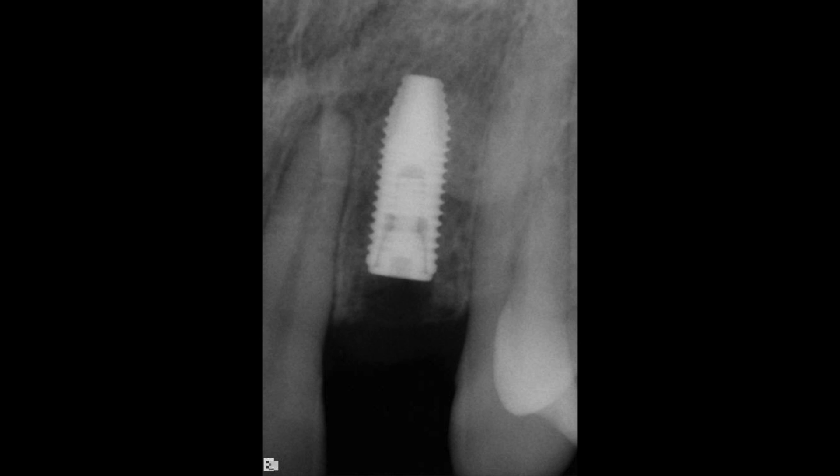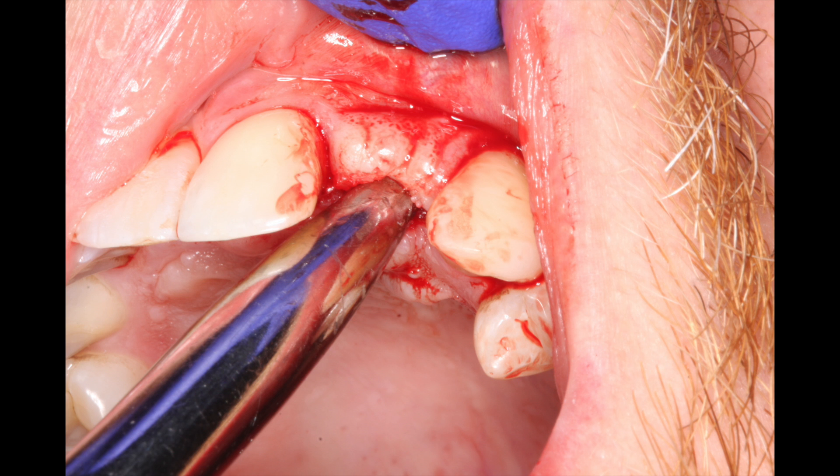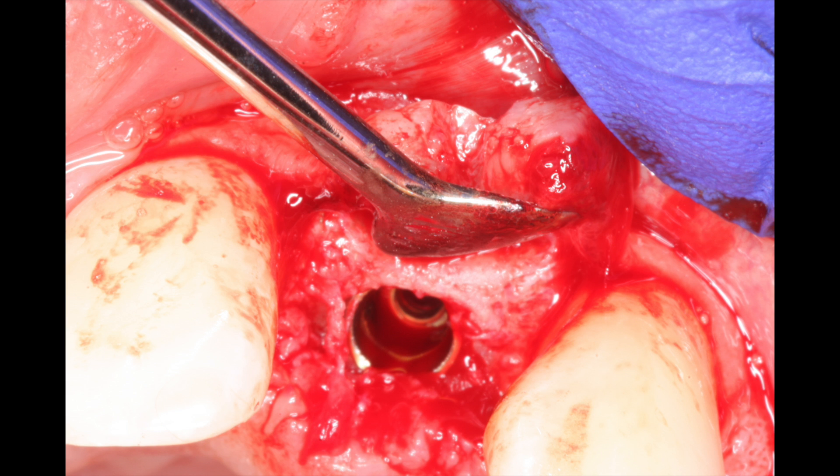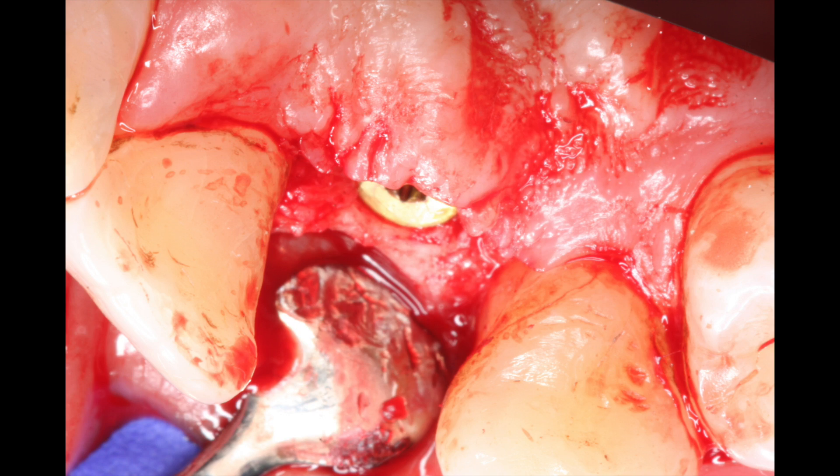After three months of healing, it's exciting when you take an x-ray and see the bone standing exactly the way you left it — not resorbing, staying up nice and high. But now we have to deal with this because we're going to have to seat an abutment that's about five millimeters wide, on a taper with emergence profile. We raise a flap, have a look, and we can see the cover screw is inside. We take the cover screw off and see how deep the bone actually is — it's a couple millimeters of depth here — so we're going to have to deal with this with the CC bone mill.